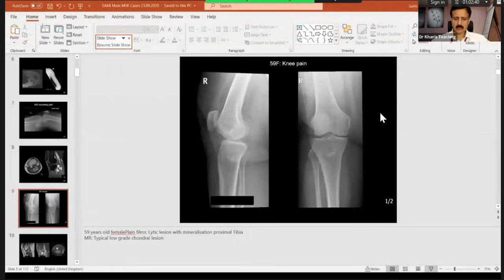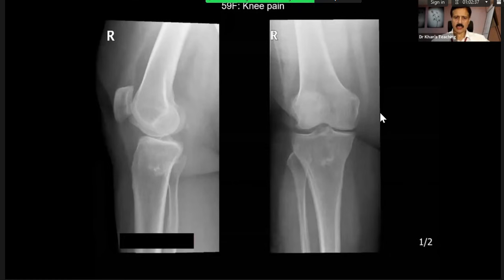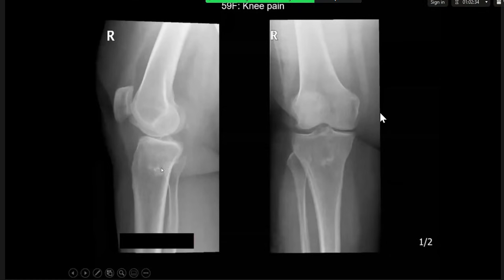Okay, this one I don't want you to tackle it, but I will basically, okay, just tell me what is, because of time factor, I'm going to ask you leading questions. What do you think is happening here? I can't see the screen. Oh, sorry. So maybe it's not shared correctly. Can you see it now? Yep. So I've got. Just tell me what is happening here.